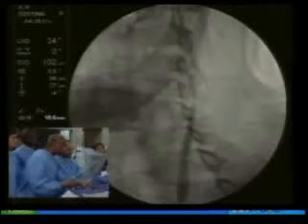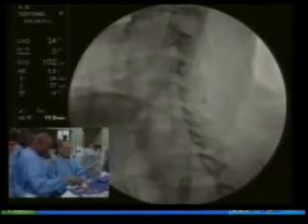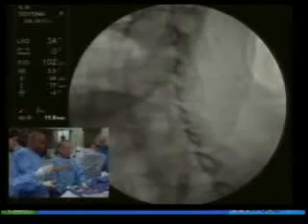So what Ty's going to do now is he can determine if we have proper protection by injecting here. So the biggest problem with all of the occlusive devices is missing the lesion. So this is one of the things that you see with the flow reversal device, losing track of the lesion. Ty, can you inject just a little more? So you actually inject. I think you can see the sheath took a little bit of work, but now we have the flow reversal. Do you want to record that slow injection?